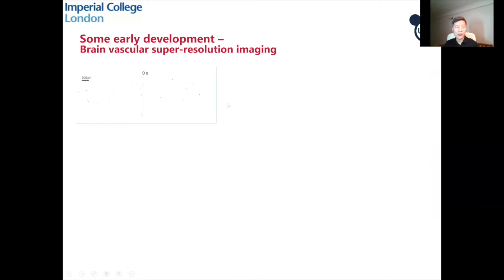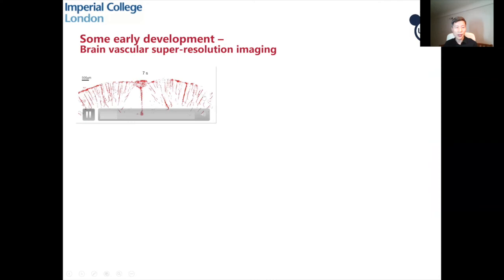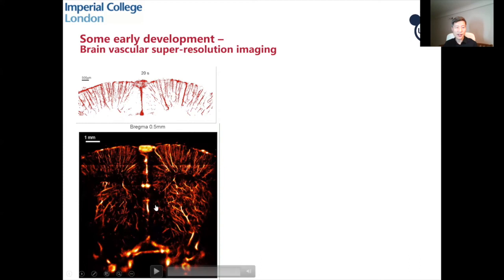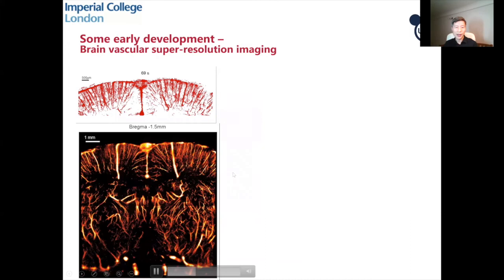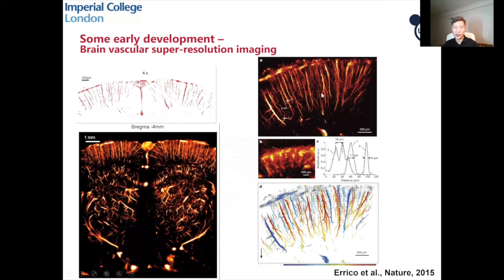This is another early development: rat brain super-resolution imaging. The video shows accumulation of signal over time in a part of the rat brain. This gives a final super-resolution result in a single 2D plane, but you can do this in multiple 2D planes and display the results in 3D.